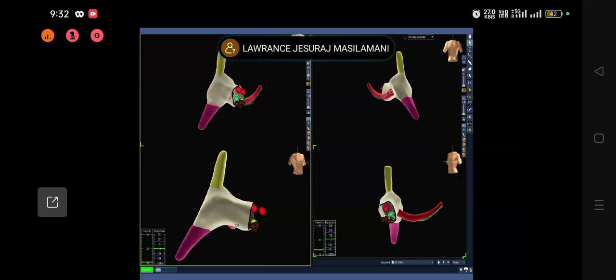This is what we saw fluoroscopically: the infero-posterior location where you see a slow pathway in most of these people. So don't ascend up. Don't ascend up. The red points tagged in this map are the ablation locations.